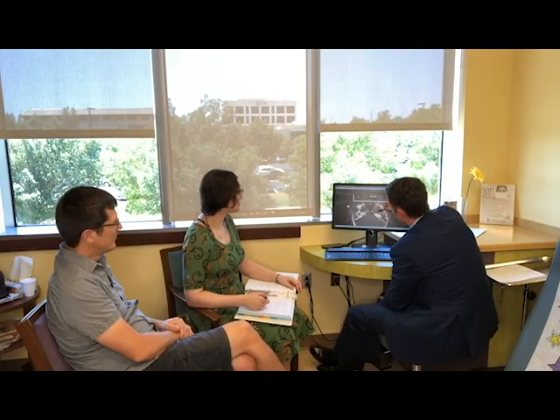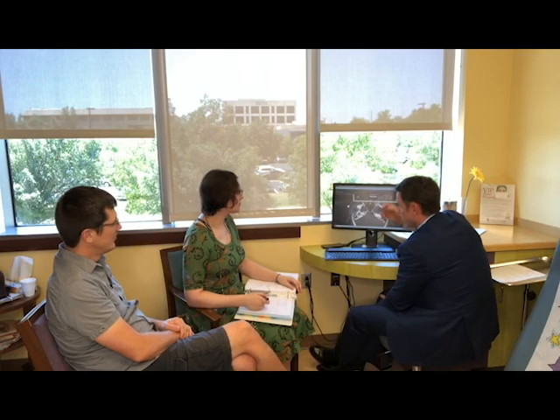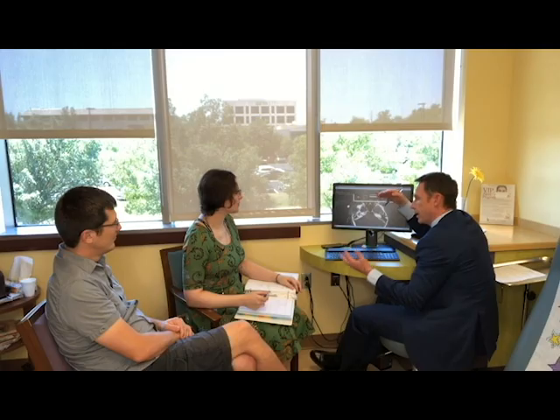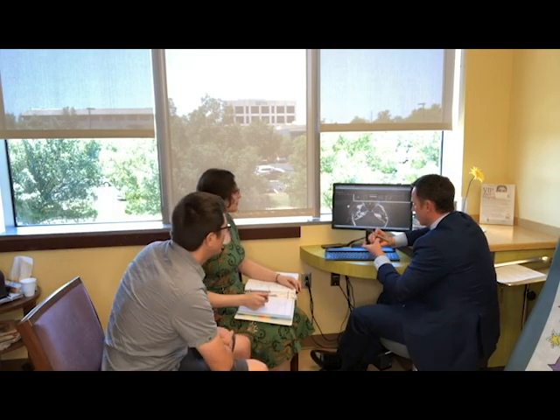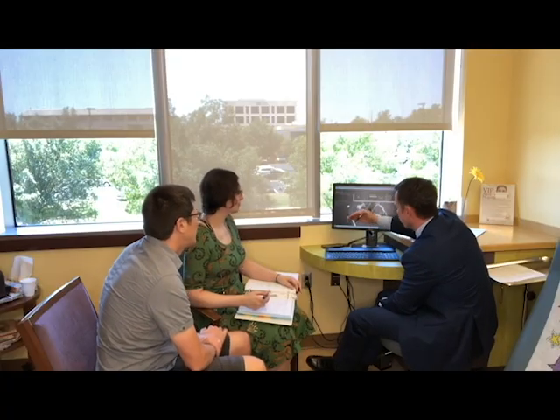This gray area we call the internal auditory canal. It houses two nerves in particular. One is what we call the vestibulocochlear nerve, a balance and hearing nerve. The hearing part goes to the cochlea, which is the hearing organ for your right side. And here is an Olympic ring looking tri-ring structure, the semicircular canals, where the balance part of that nerve goes.